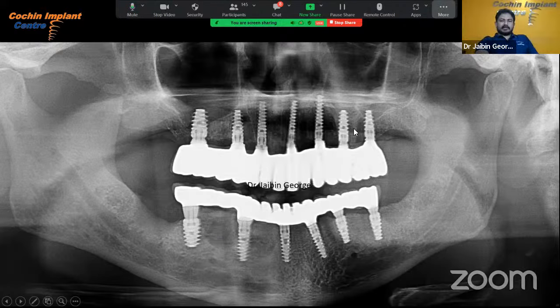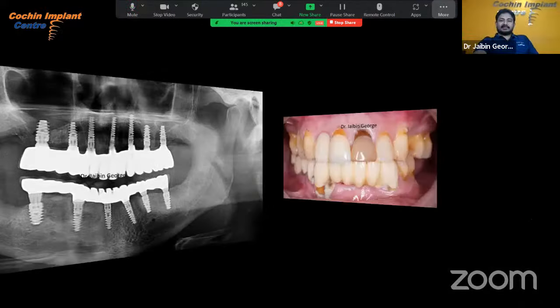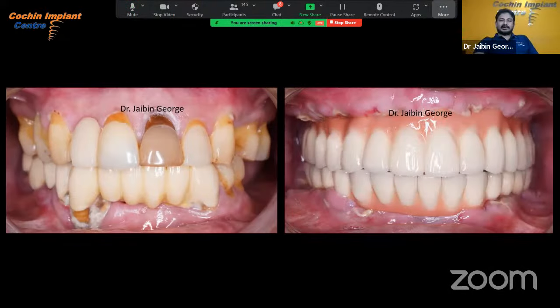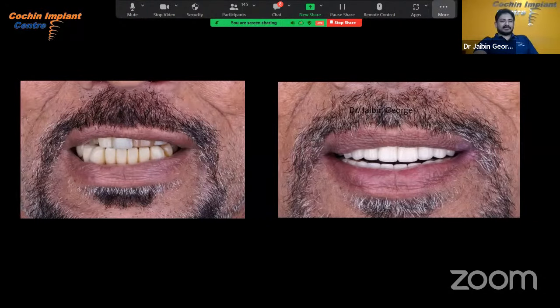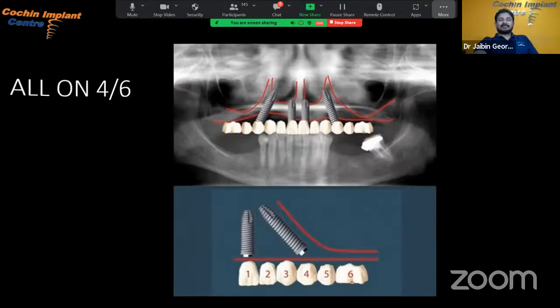The distal most implants were with crestal lift, but those implants had good primary stability, more than 40 newtons. So I decided to load it immediately. So this is before and this is after. This is before, this is after. So that's about straight implants.